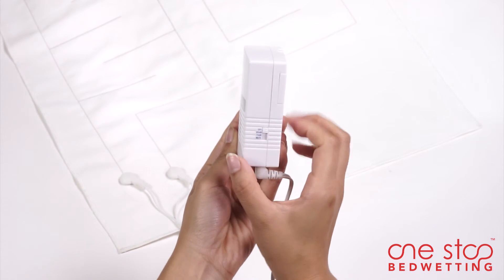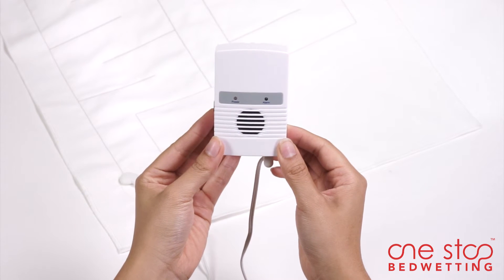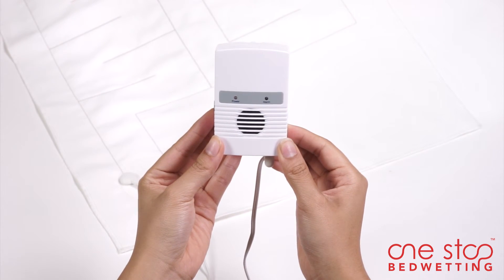Once awakened, shut off the alarm with the 4-in-1 control switch. Reattach the mat to the alarm unit to begin monitoring again.